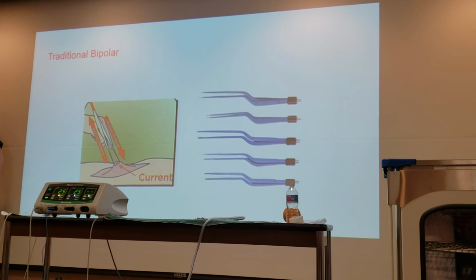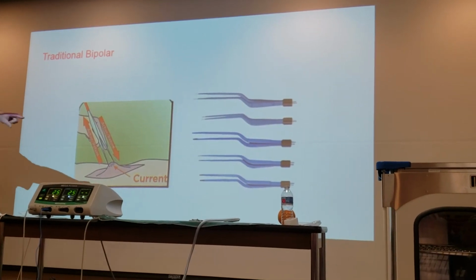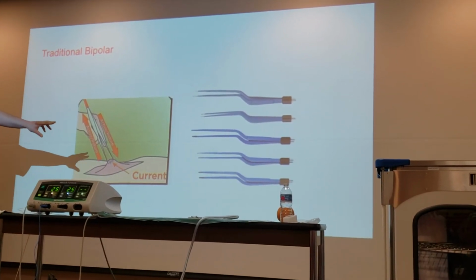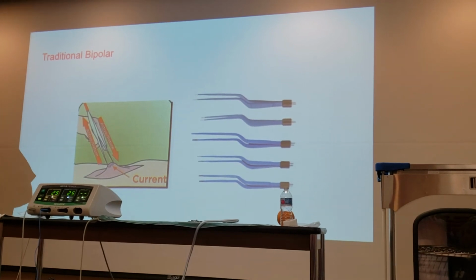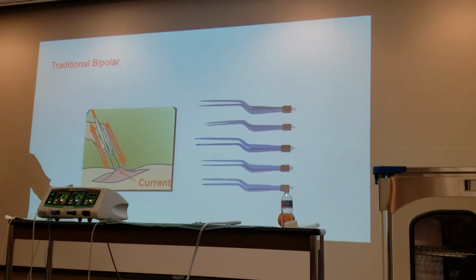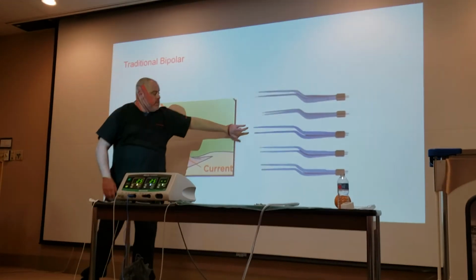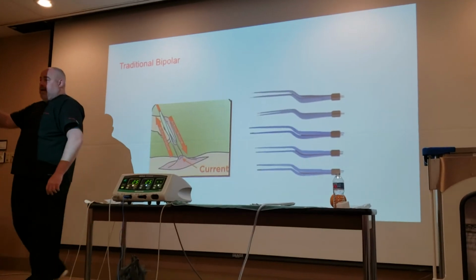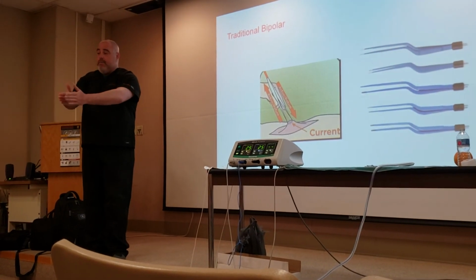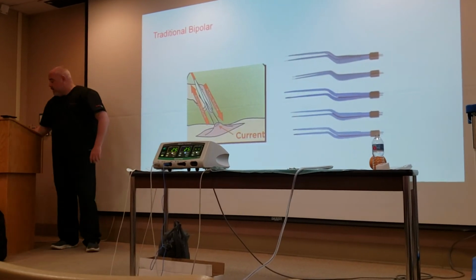So we talked about monopolar. Monopolar is simply, again, high current concentration to a dispersive pad with an alternating current. What's bipolar doing? If I have high current concentration at a Bovie pencil and a pad, I am now taking those 2 tips and they're in the tines of these forceps. So think of one of those tines as the pencil and the other as the pad, and I'm bringing it together. The other thing that I'm doing is I'm using cut current and cut current only.